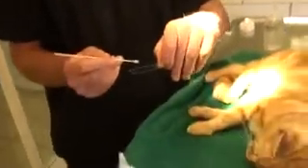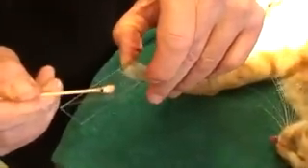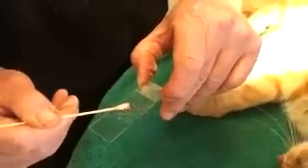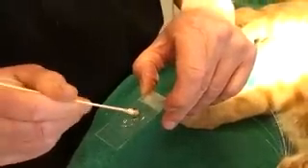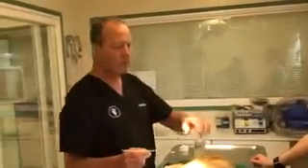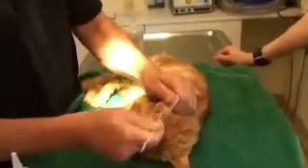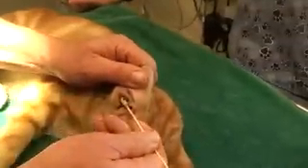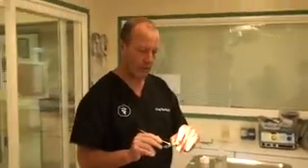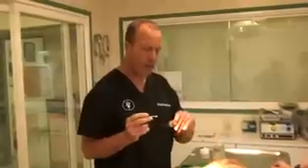So if we put some of that on the slide, you don't have to do that at home because you don't have a microscope. But if you see that kind of blacksy stuff, 9 times out of 10 it's a mite infection. Especially when you saw how much this little cat was itching his ears. So I'll show you what a real mite looks like under the microscope. And then we'll put some stuff in his ears to cure the mite infestation. However, they're already starting to drown now because we're putting mineral oil on. And they're going, I can't breathe.